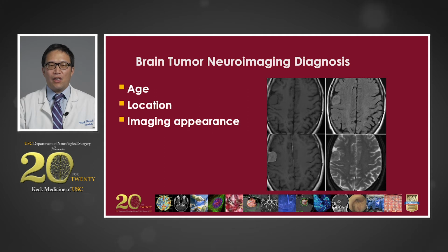As you can see in the top left image, that is a T1 weighted image, where you can see that the white matter, which is the structure of the brain that is more central, is brighter or more hyperintense than the gray matter, which is overlying the white matter in the cortex, which is a bit darker or hypointense. And you can see the suspected meningioma overlying the right frontal cerebral hemisphere convexity, and it looks very well circumscribed, sharp borders, and definitely extraaxial.